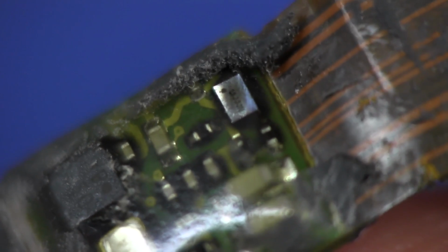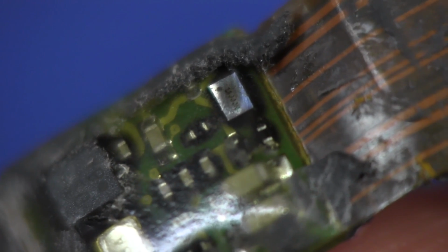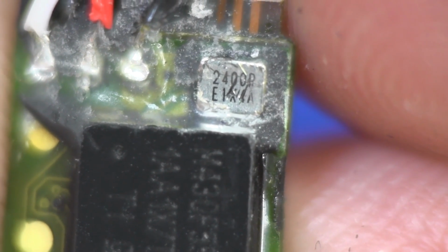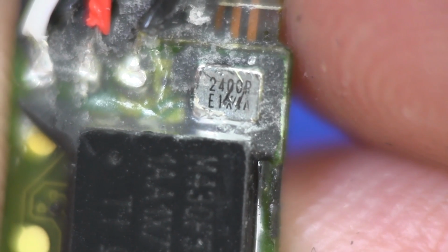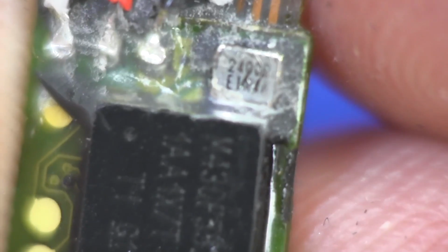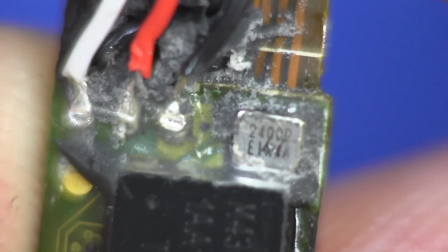And there are a couple of candidates on here. There's that bare die flip chip down in there. It's got JJN marked on it. I'm not sure. There's another device there with not much marked on it, the black one. That one there, I believe, is the crystal. And the other candidate would be this little sucker, which has 2400p and E1 something else on it. I've actually scratched the top of that with my knife when I was digging out the rubber, but one of those devices will be the MEMS accelerometer on there.